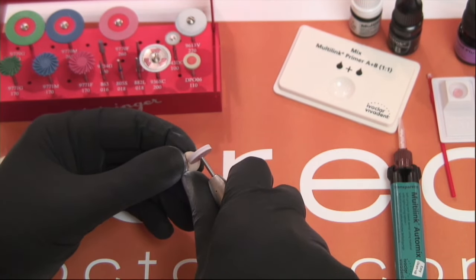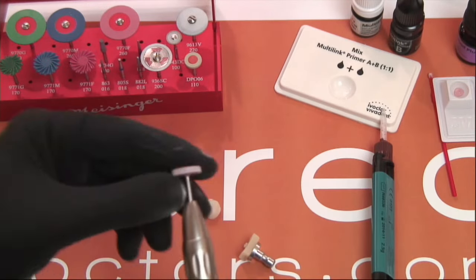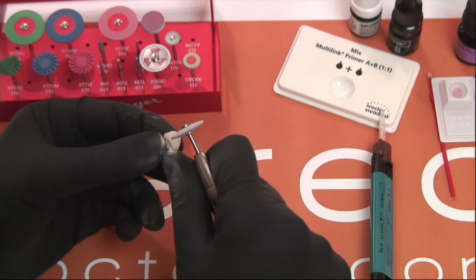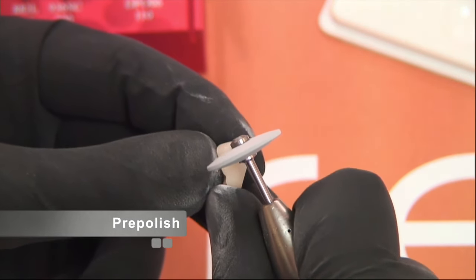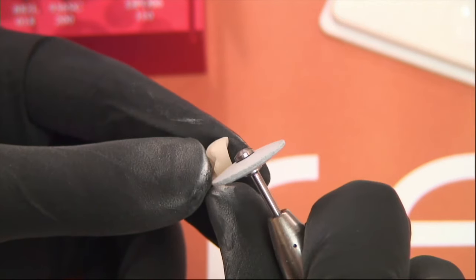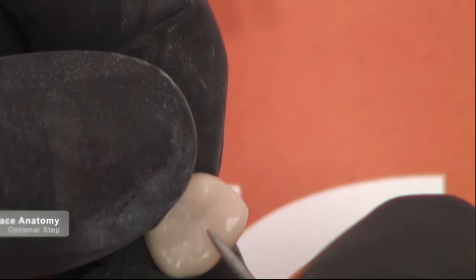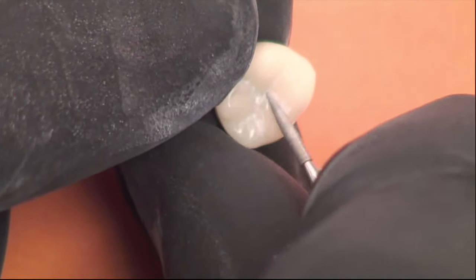If there are any contour changes to make, you can also use that burr to make those changes. The next step is to smooth and pre-polish. If there are any burr marks, we'll use the 9613 burr in the kit and just lightly go over the margins and contour to pre-polish and smooth out the restoration to prepare it for the final polish. You can also use the 863 burr prior to polishing to put in some anatomy, since the milling unit has fairly large burrs.